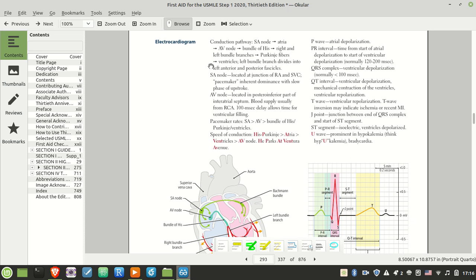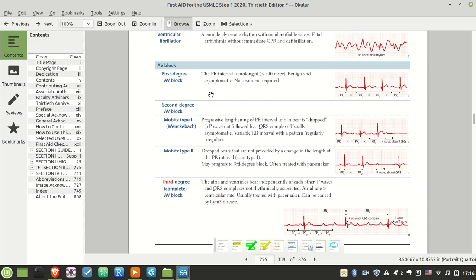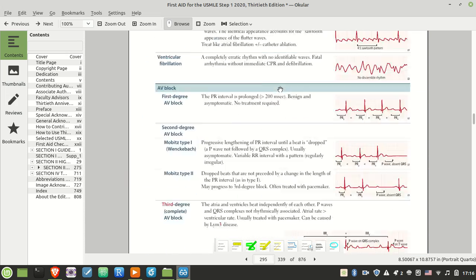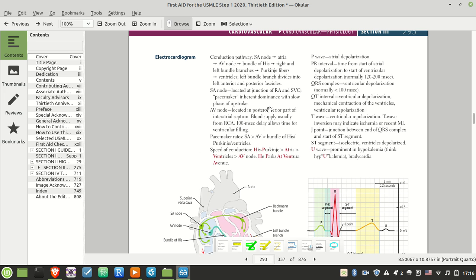So, electrocardiogram, EKGs. I don't think you guys really go into EKGs too much here, besides just identifying different types of stuff. But I don't think there's any talk of axes and whatever. So if you consider this a normal EKG, that's what everything's going to talk about. So let's go through this bit by bit.